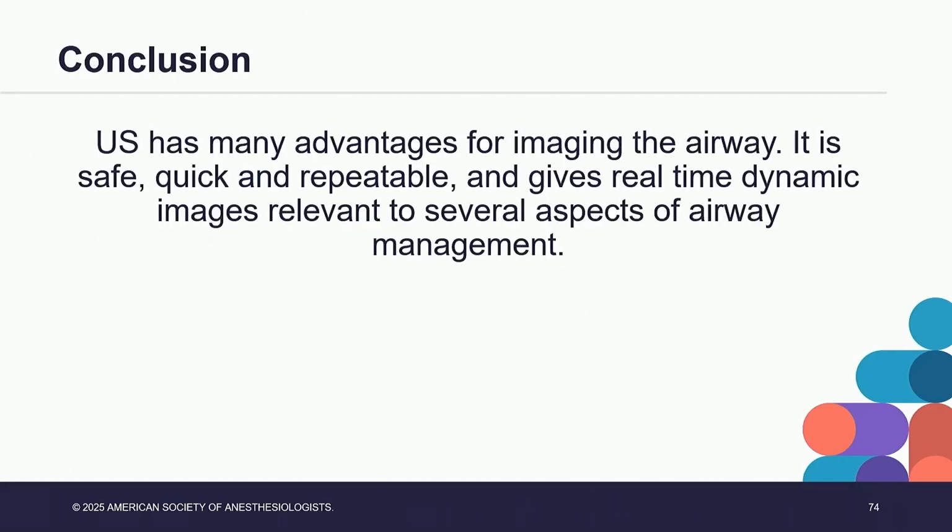So the conclusion is that ultrasound has many advantages for imaging the airway. It is safe, quick, and repeatable, and gives real-time dynamic images relevant to several aspects of airway management.